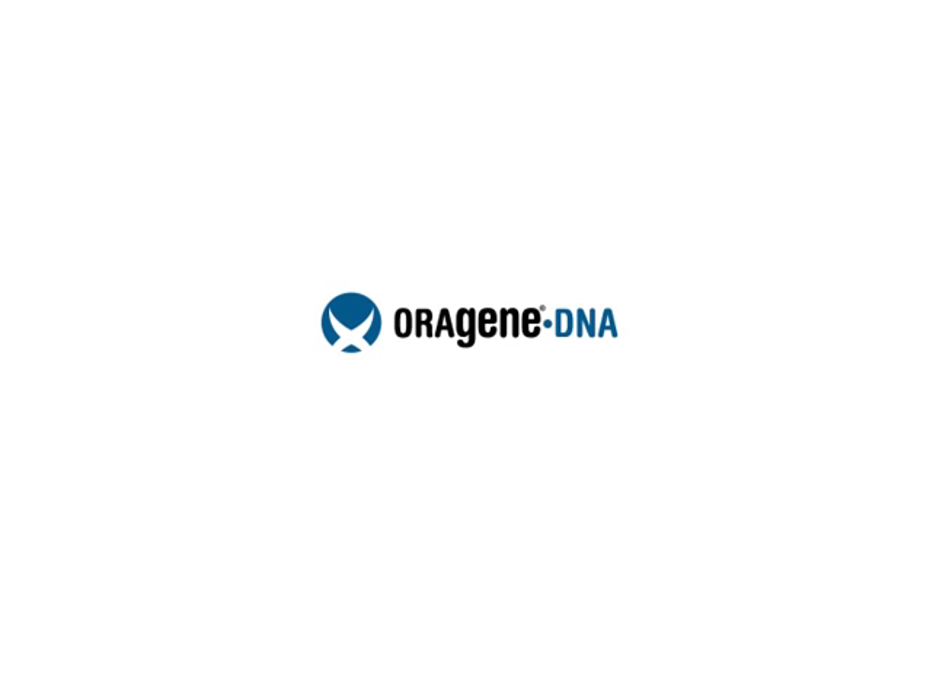Oragene DNA is easy to use, non-invasive, and ideal for the safe collection of DNA from saliva.